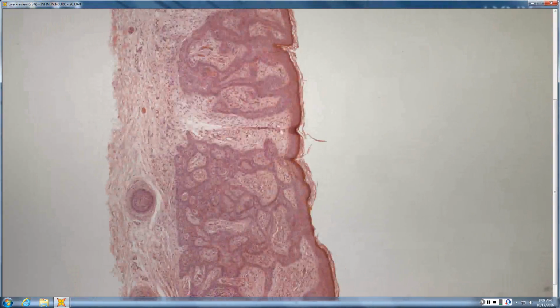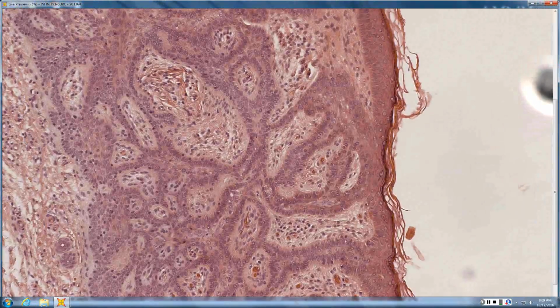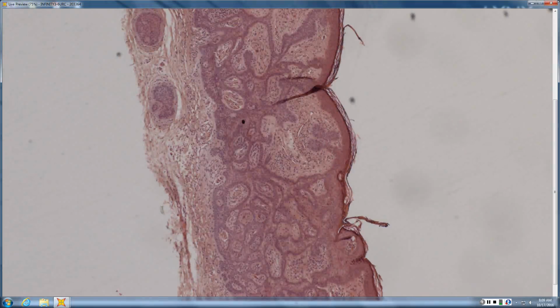Okay, so Blake, how about this one? It looks like a reticulated pattern off the epidermis. And what color is it predominantly? Mostly blue. It's similar in color to your epidermis, right? But then you definitely have some more bluish tips. So I'd say it's more like pink anastomosing strands, blue buds.